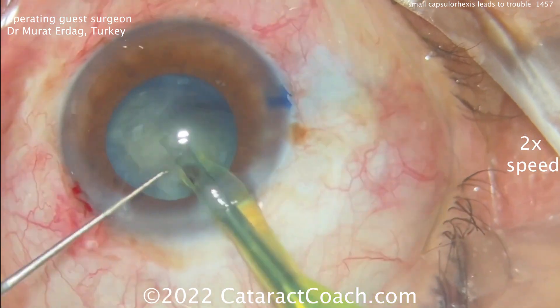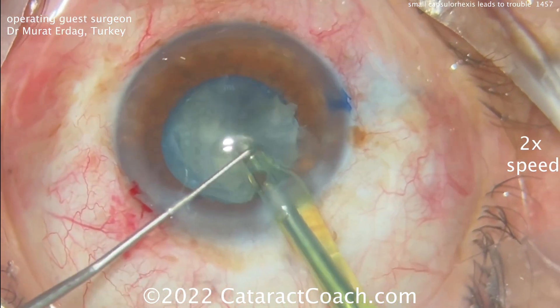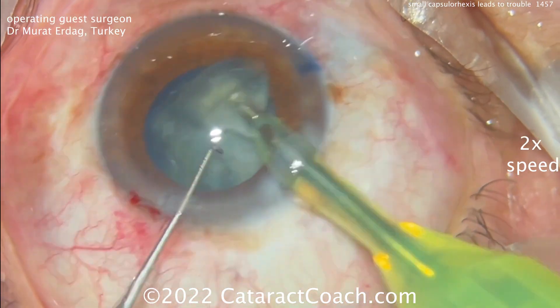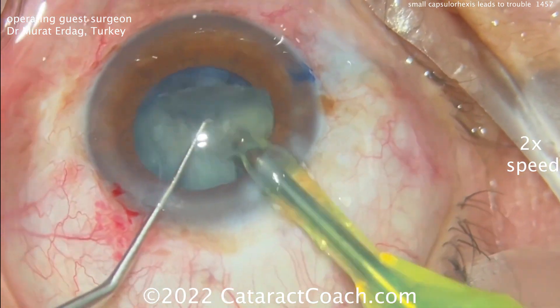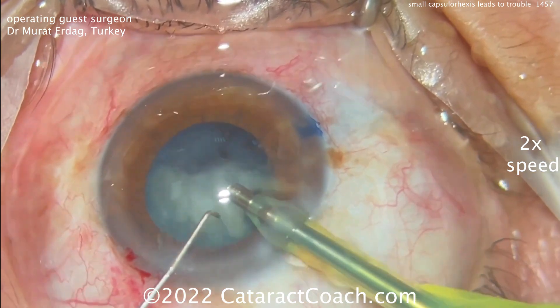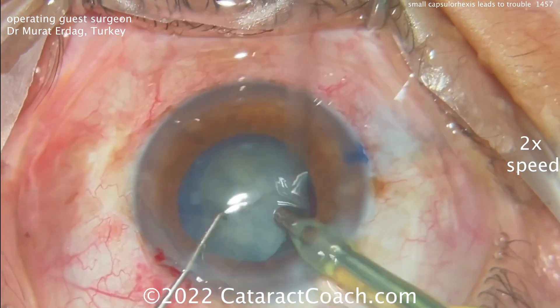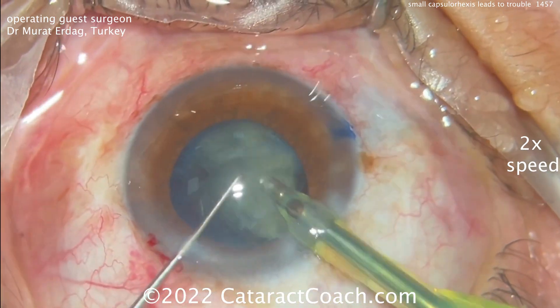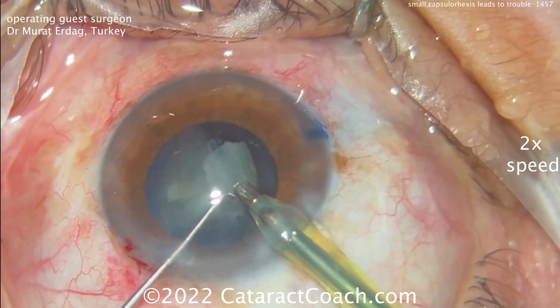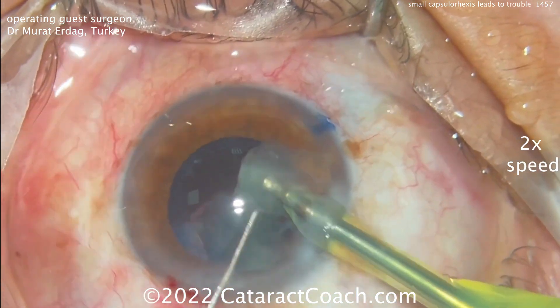Removing the cataract pieces — no complication yet, have you noticed? Taking out the next piece. About a hemi-nucleus is left in the bag; let's take that one out. Here's another quadrant — we can sub-chop or split it again. Last big piece of nucleus, bringing it up, further chopping and removing it. So far so good — where's our complication? Because there's definitely trouble ahead; that's the name of this video.